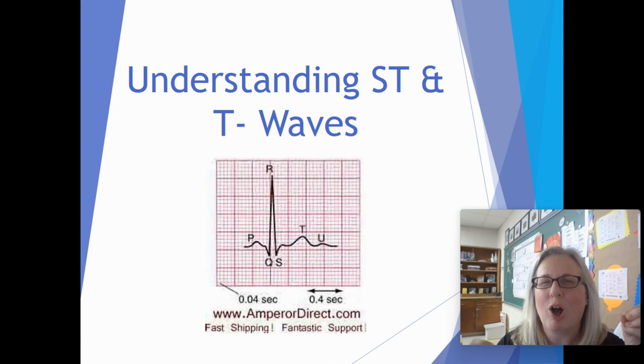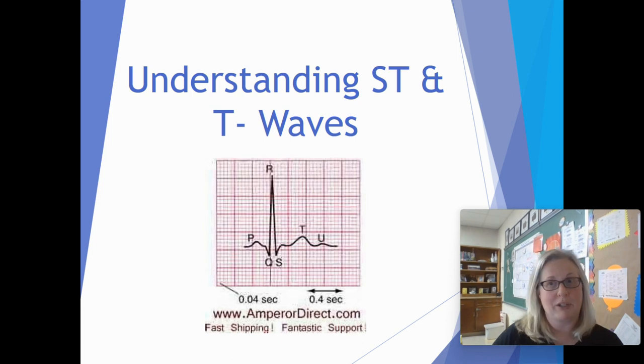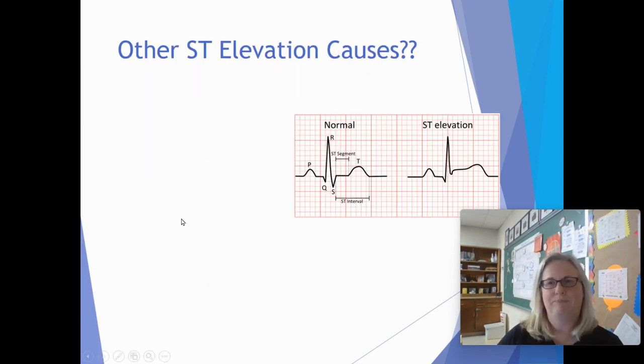Just when you thought you knew it all, yeah, we're going to throw you a curveball and throw a few more things in there. Okay. So a little bit more on understanding ST segments and T waves is what we're talking about today. So let's just get right into it.